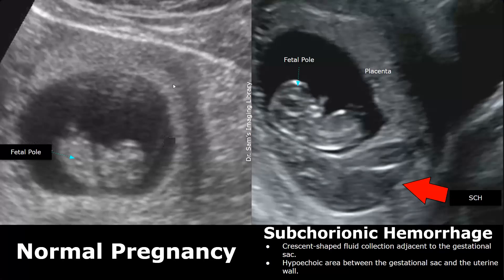In the image on the right, there is a prominent hypoechoic crescent-shaped fluid collection adjacent to the gestational sac. It is also near the margin of the placenta. This is the subchorionic hemorrhage.